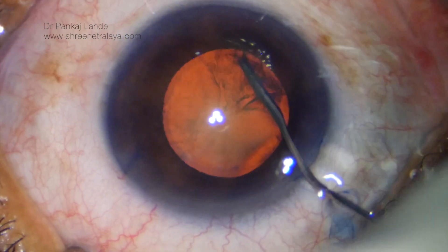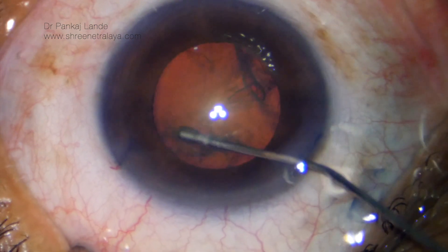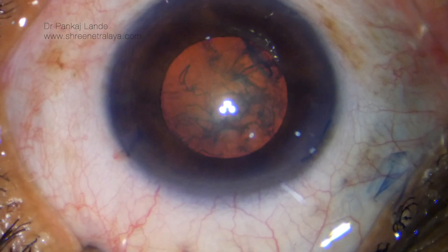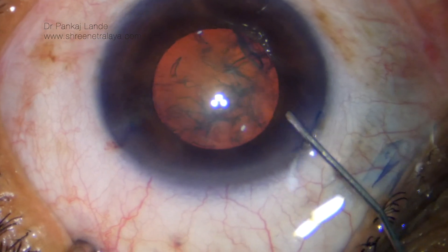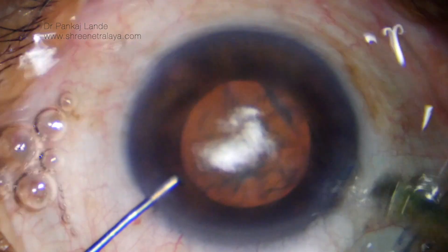Hydrodissection is performed with a 27 gauge cannula and the nucleus is rotated slightly. The anterior chamber is again formed with viscoelastic and the phacoemulsification steps begin.